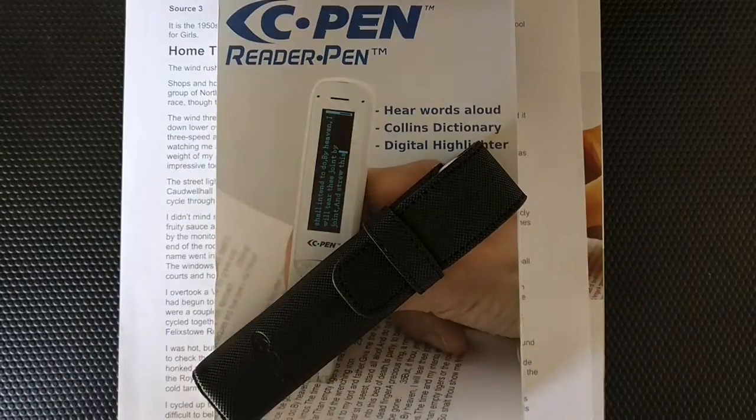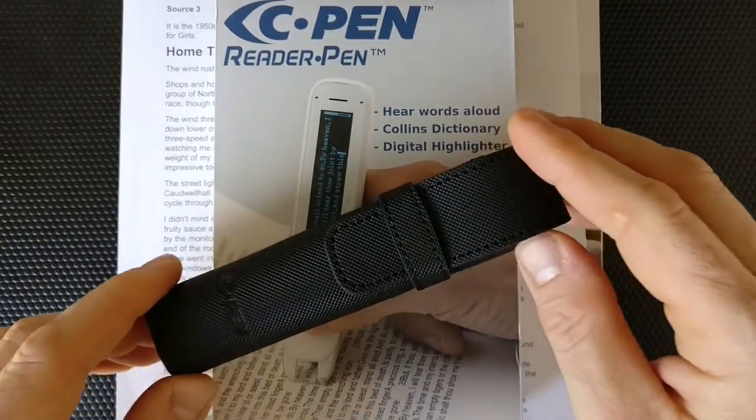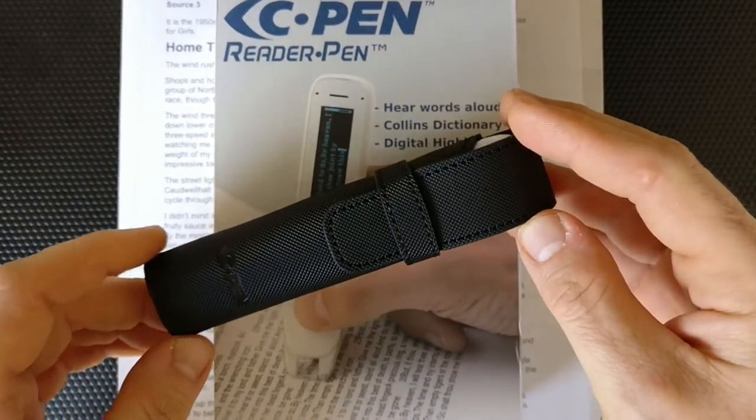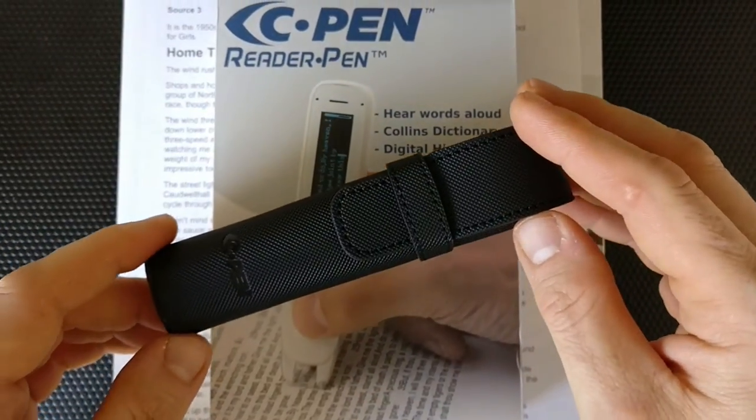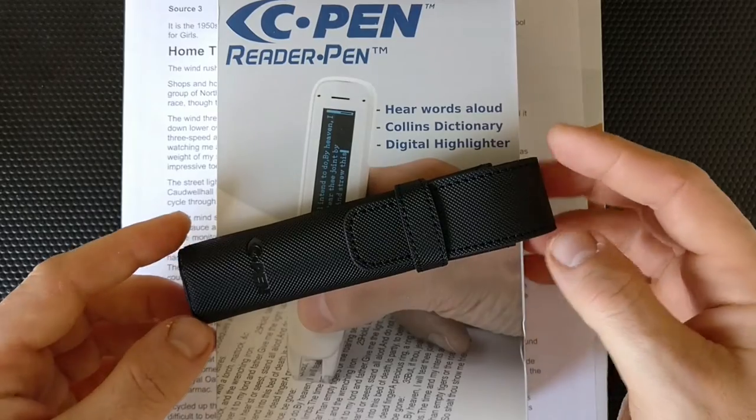In this video, we're going to have a detailed look at the C-Pen reader pen and its reading functionality. In a separate video, we are going to look at all the additional functions of the reader pen.